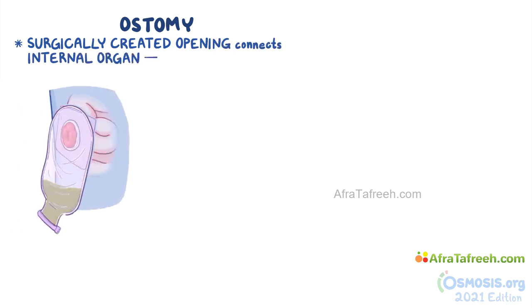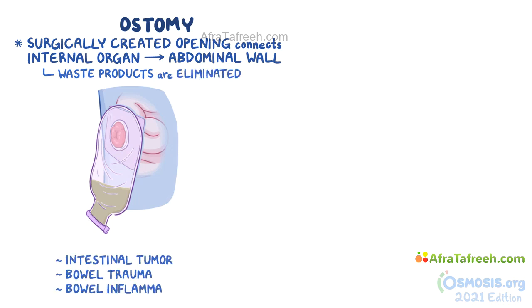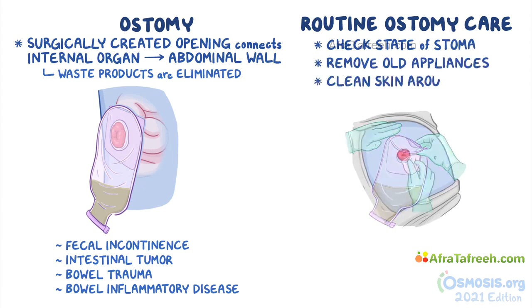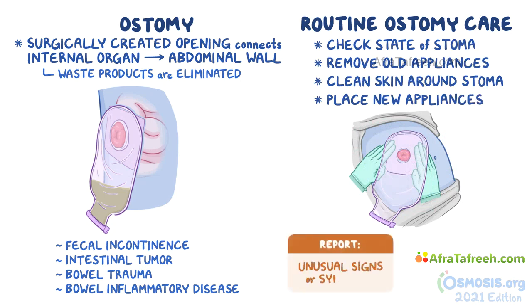Alright, as a quick recap. An ostomy is a surgically created opening used to connect an internal organ to the abdominal wall, through which waste products like intestinal contents are eliminated. This can be done because of a tumor, bowel trauma, bowel inflammatory disease, or fecal incontinence. Routine ostomy care is done to check the state of the stoma, remove old ostomy appliances, clean the skin around the stoma, and to place new appliances. After the procedure, remember to report any unusual signs or symptoms to the nurse and document your observations.